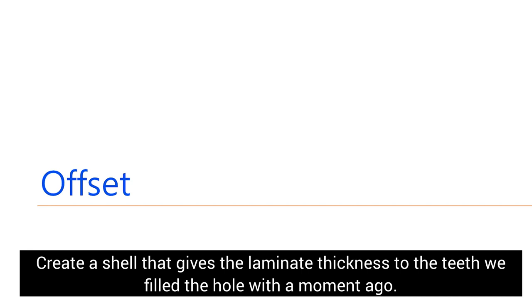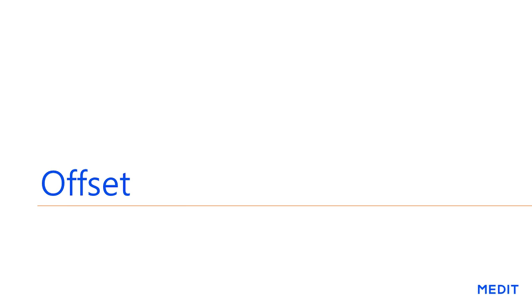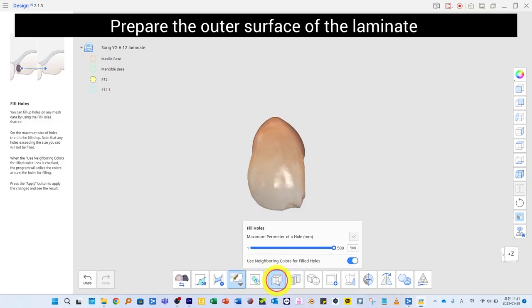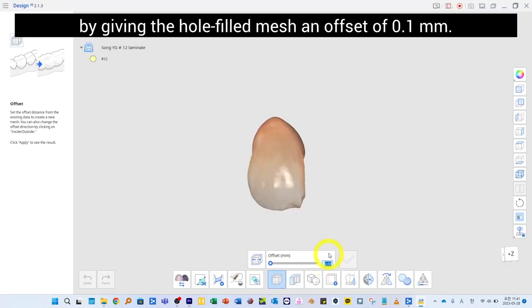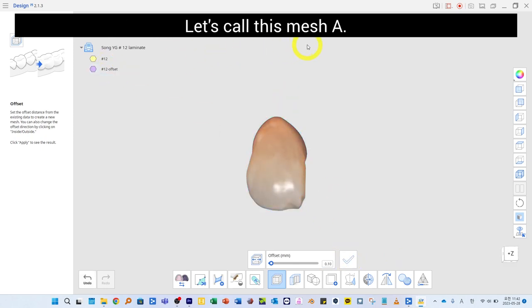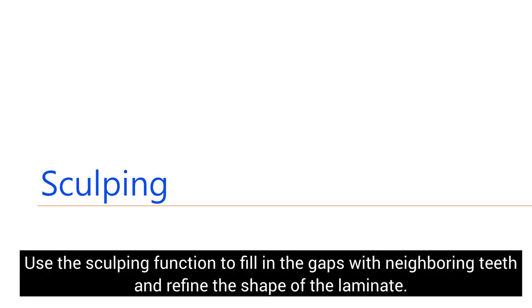Create a shell that gives the laminate thickness to the tooth mesh we filled the hole in. Prepare the outer surface of the laminate by giving the hole-filled mesh an offset of 0.1 millimeter — call this mesh A. Use the Sculpting function to fill in the gaps with neighboring teeth and refine the shape of the laminate.